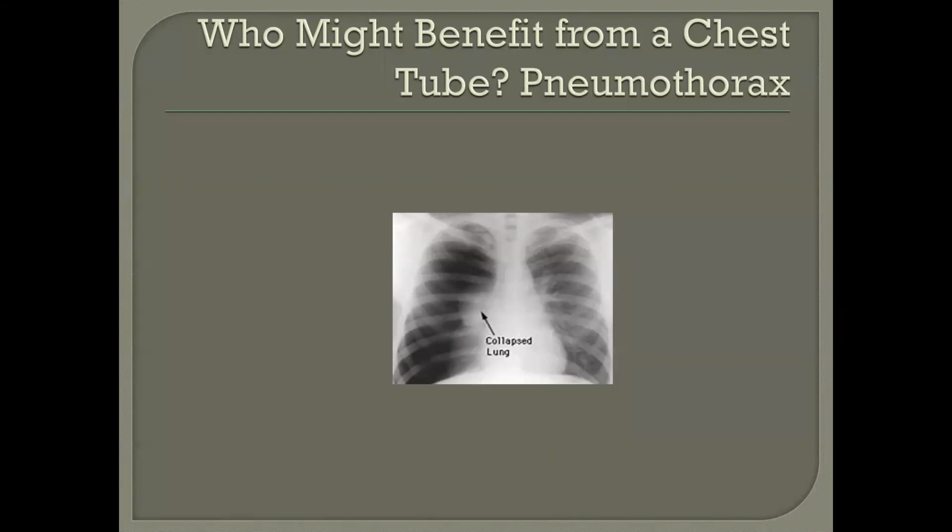So it's like a lot of things. The more experience you get at interpreting chest X-rays, the better you get at it. This is a complete pneumothorax on one side, because it could be very subtle ones. It's just a slight pneumothorax. It may be clinically insignificant. They may administer 100% oxygen if it's a small pneumo, because, if you will, the density issue, it may facilitate absorption and the rectification of a small pneumo. A large pneumo needs a chest tube, and if not a chest tube in the field, a needle thoracostomy.